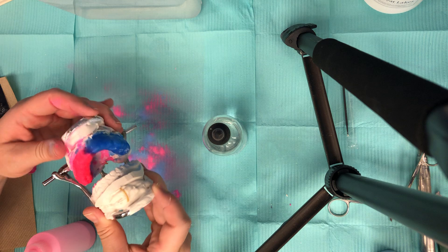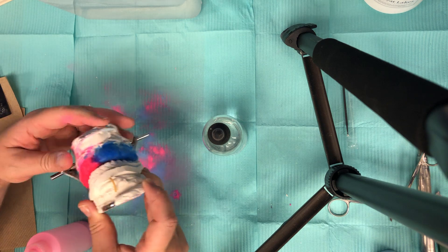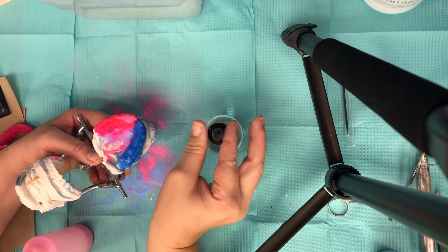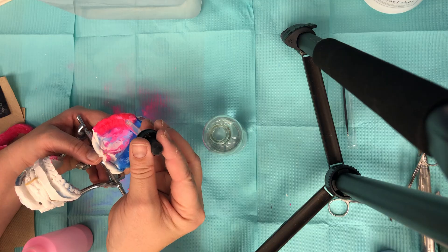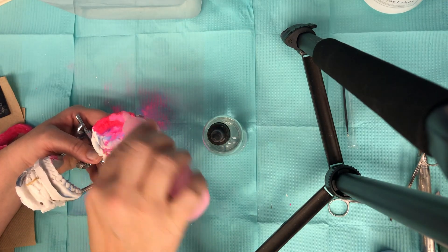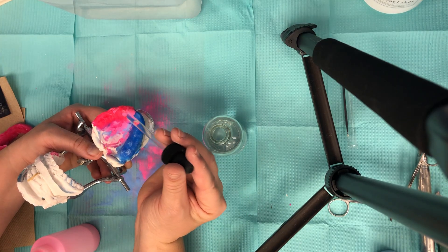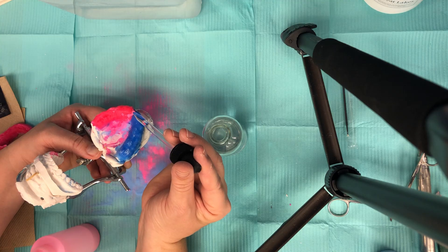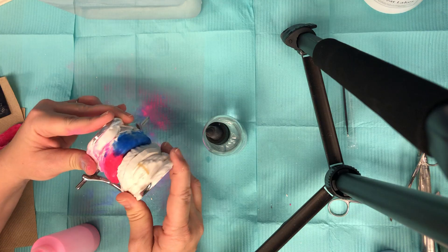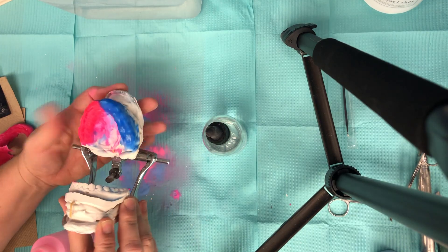Just need to build it up a little bit where the centrals and laterals are touching. Perfect — all right, good indentions. Now let's work with the blue.